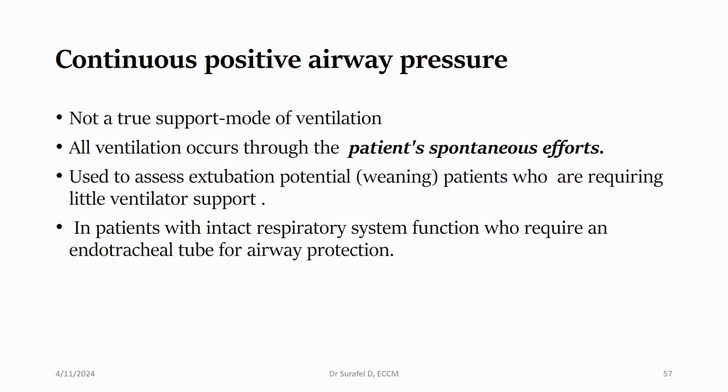Okay. So the last one will be CPAP. CPAP is the commonest used ventilation, especially for patients with mild respiratory distress, for patients with acute cardiogenic pulmonary edema, and for patients with acute asthmatic exacerbation. You can also use CPAP as post-extubation management. It's not a true support; it's just a pressure support. All ventilation will occur through the patient's spontaneous effort, so all ventilation is dependent on patient spontaneous effort.